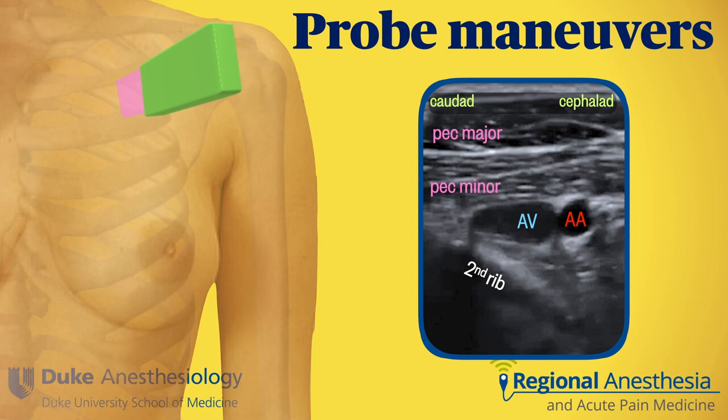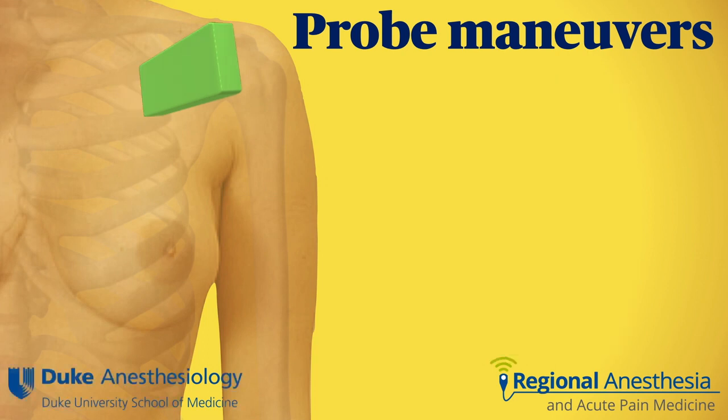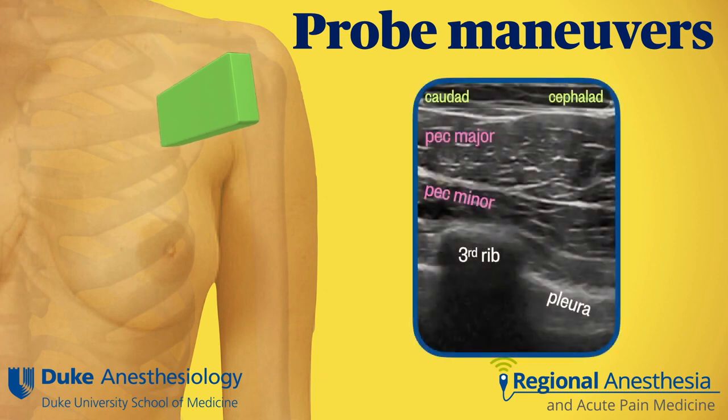This has the effect of bringing the chest wall into view underneath the axillary vessels. Counting the ribs is crucial, and we want to know which rib is which. The rib directly underneath the axillary vein is the second rib. From here, the probe is translated inferiorly and laterally until the next rib is encountered.